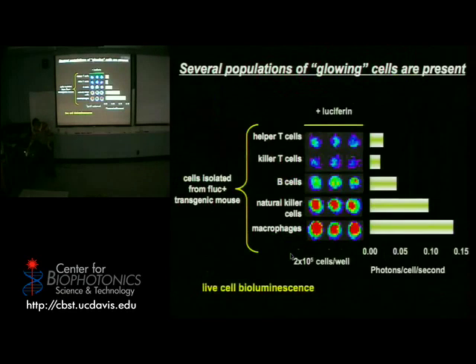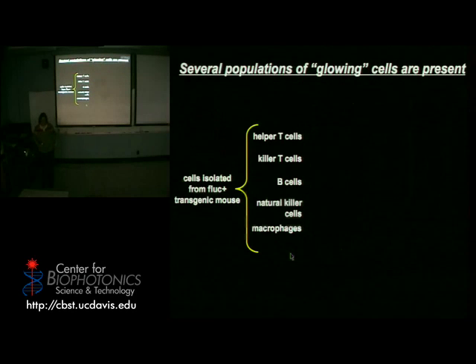I have a question. Yep. Is that mouse going to just glow forever, or is it... It's a great question. Luciferin does get used up, and you kind of saw at the end of those images how the signal trails away. So there's some tricks you can play if you want the mouse, let's just say, to glow forever. You can actually build a pump that delivers a certain amount of luciferin all the time to that animal. Or you can simply inject more, or formulate the luciferin into something like aspirin would have slow release properties. So there's all these sorts of cool tricks you can play to prolong your signal if necessary, but it will go away over time.